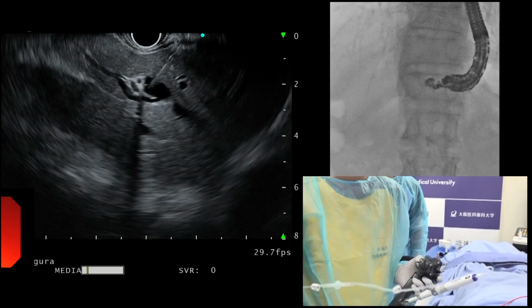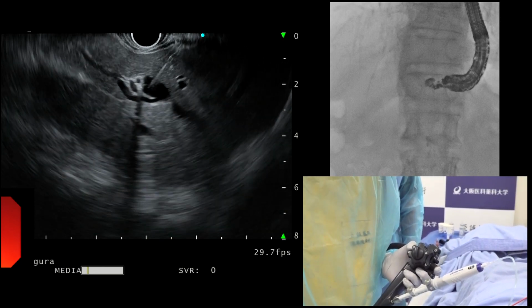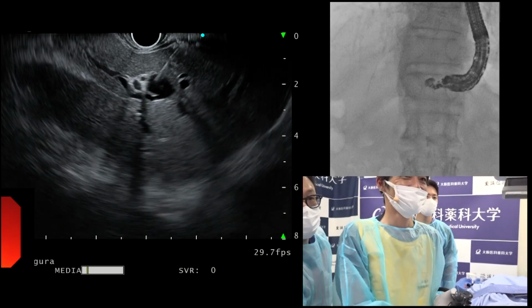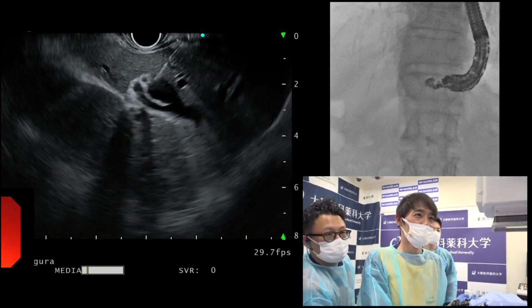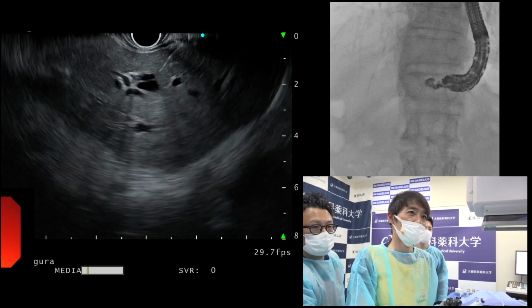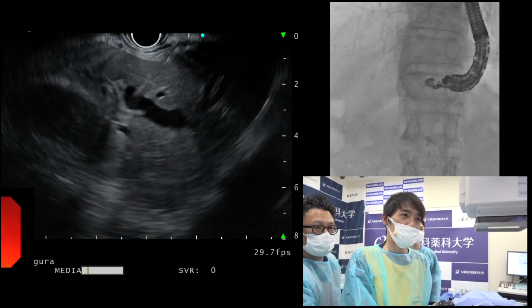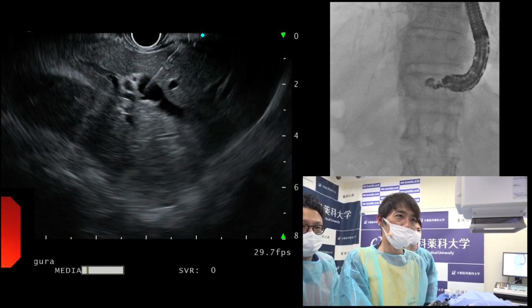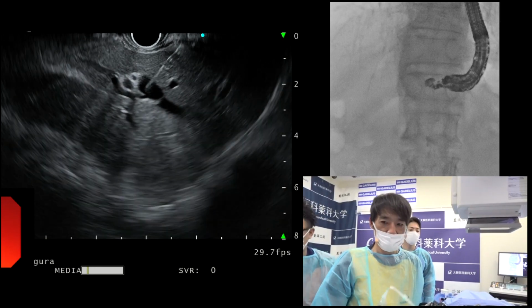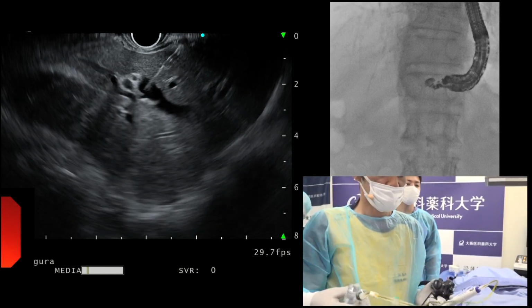Yes, angle tip, and also very soft. Is the J-wire a monofilament wire? Is there a risk of stripping as you advance the wire through your needle? No.